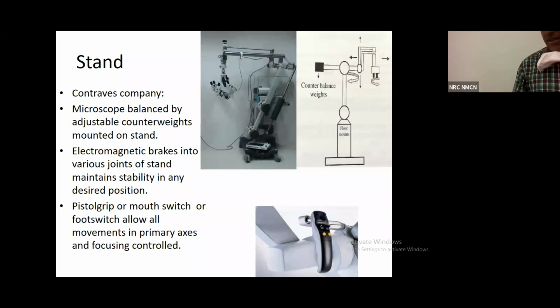Now this stand is pretty heavy. To move such a microscope would mean an enormous amount of energy every time a surgeon wants to move it, and believe me, we keep on moving the microscope every 1 or 2 minutes. So definitely the surgeon would get tired. But it is very easy. It is just a touch of a button. You just touch a button and you can move the entire handle or the stand of the microscope very easily.